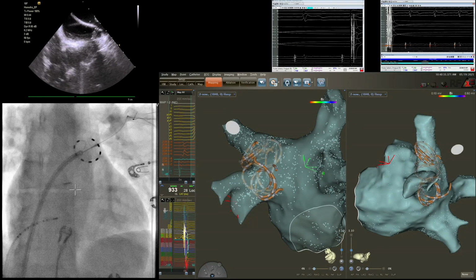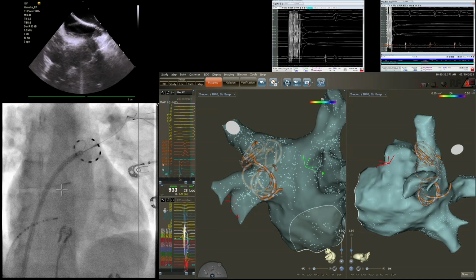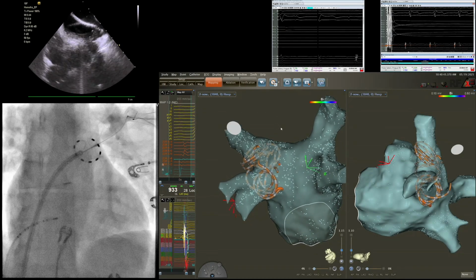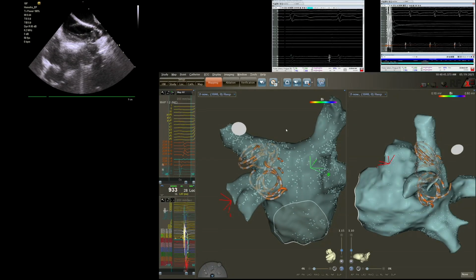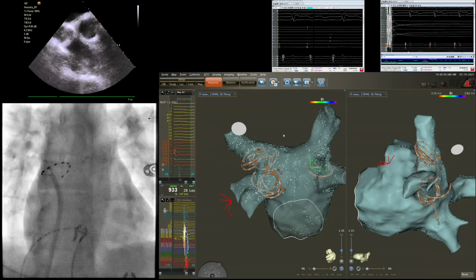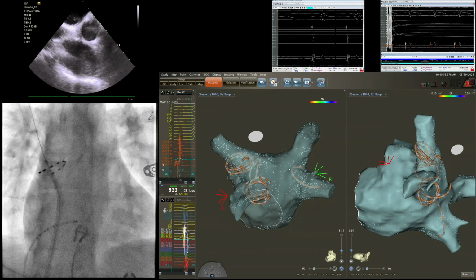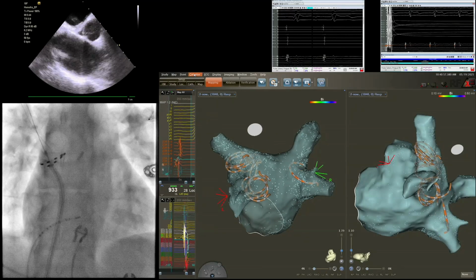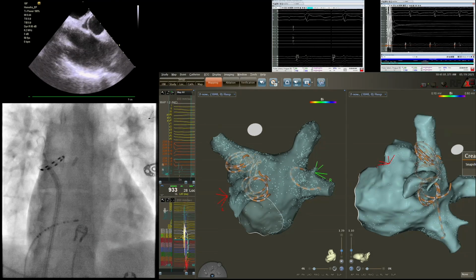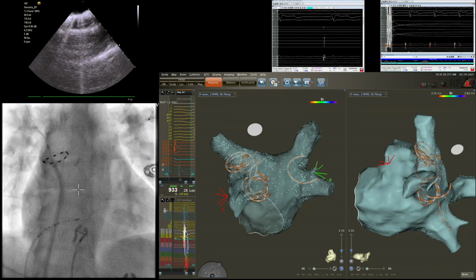Okay, for changing the position, I will always use the horseshoe shape. Okay, done. That's good. Perfect. Okay. Toshi, let's move the wire, please. Wire out. Perfect. We are there. Now go. No, the wire is not working well. Okay, more inferior, please. Okay, nice. Perfect. Okay, and go. Perfect. Nice.